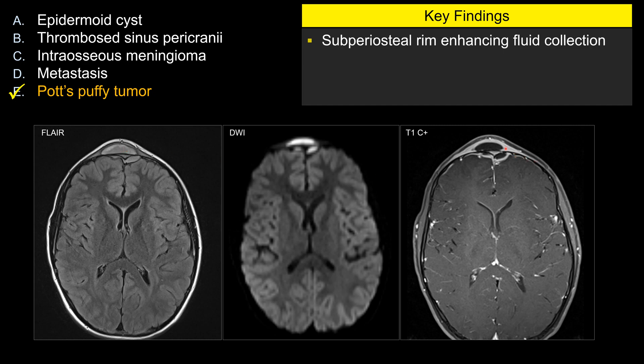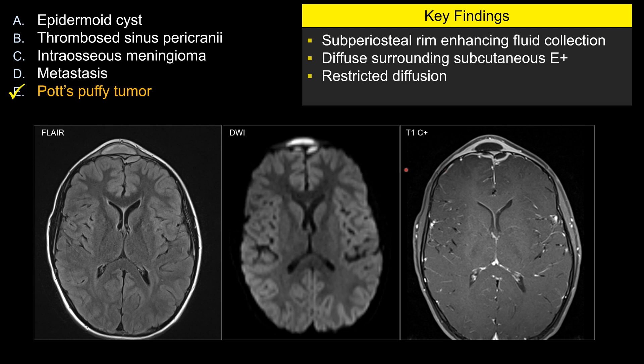On the post-contrast images, there is rim enhancement. There is also diffuse enhancement in the surrounding subcutaneous tissue, showing a diffuse inflammatory process. Additionally, there is intracranial involvement with a rim-enhancing collection. That intracranial collection, as well as the extracranial collection, both show restricted diffusion.